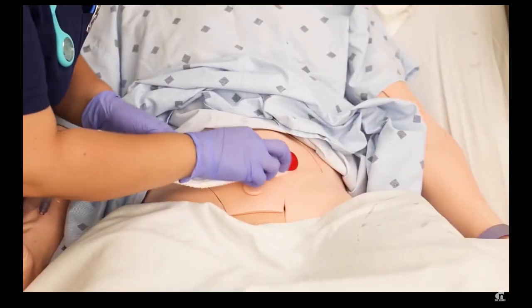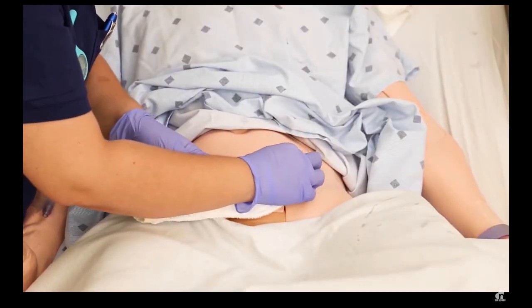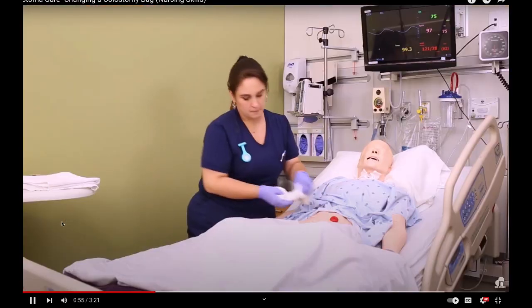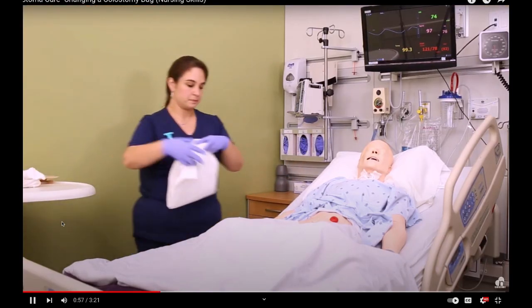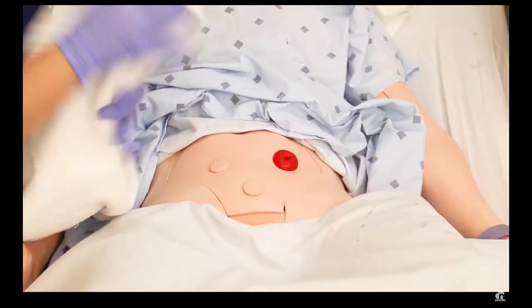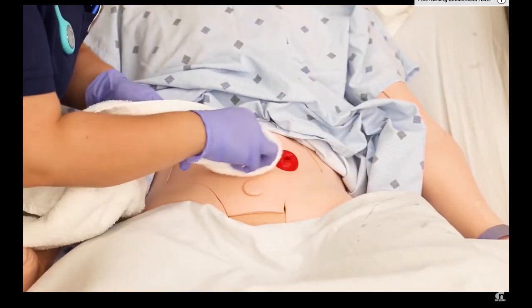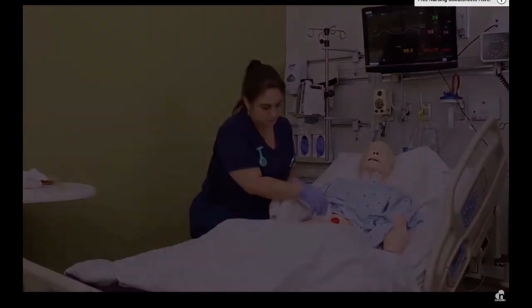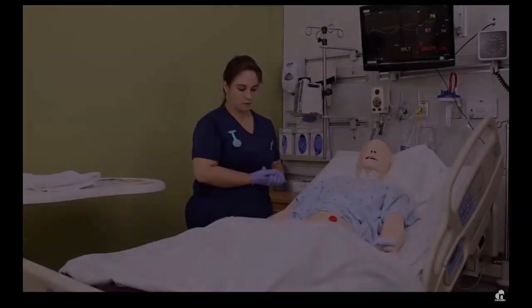Now you want to clean the stoma and around it with a washcloth with warm soapy water. Just use gentle strokes. You don't want to scrub. Then you want to pat the skin dry with a towel. Again, don't rub, just pat. So now that the stoma is clean, you can actually do your assessment.